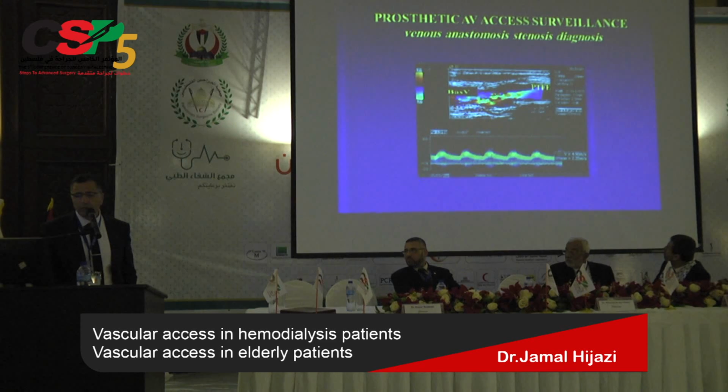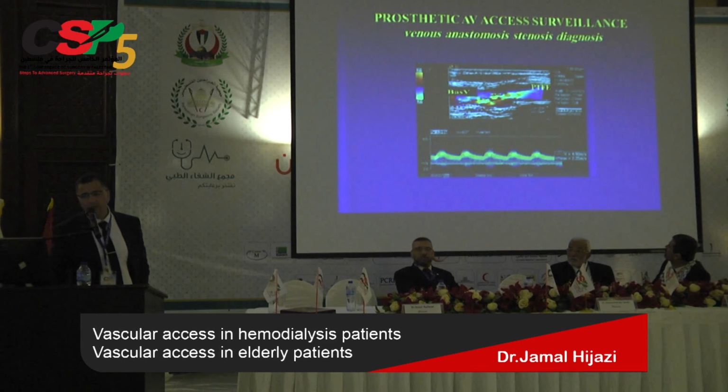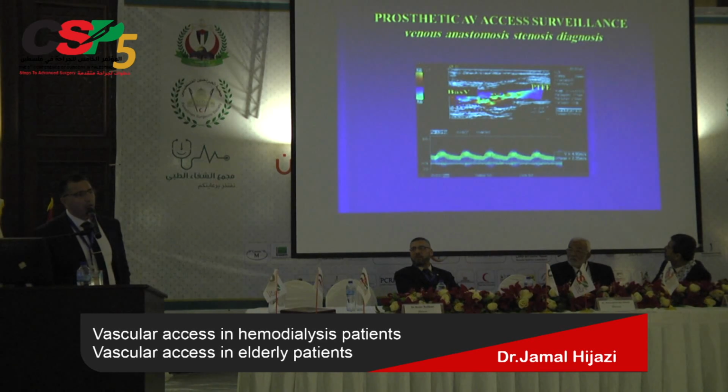And here's a sequel. As I said before, we have to do ultrasound all the time to see if there is any problem with this fistula. For example, this patient had continuous bleeding from the puncture site.